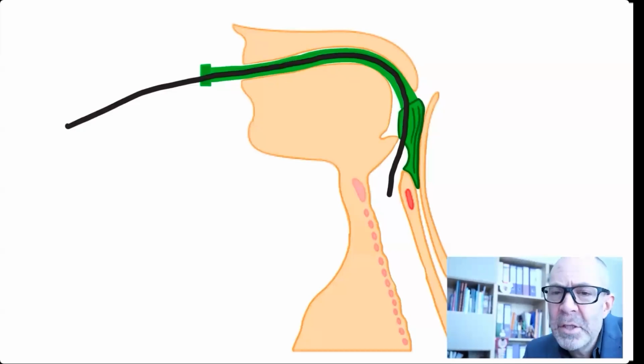There's not many ICU patients that you would do a tracheostomy on that will manage with a supraglottic airway device, mainly because we're doing the tracheostomy because we can't ventilate them so well. And so that usually mandates an endotracheal tube with a cuff on the end of it.